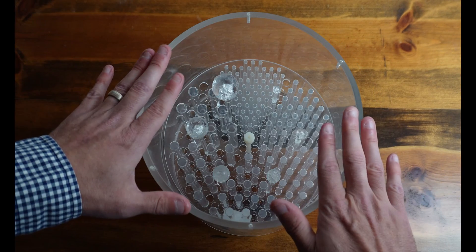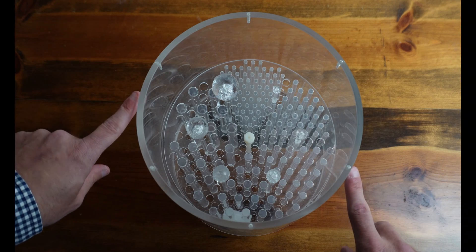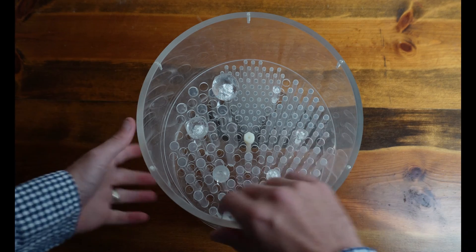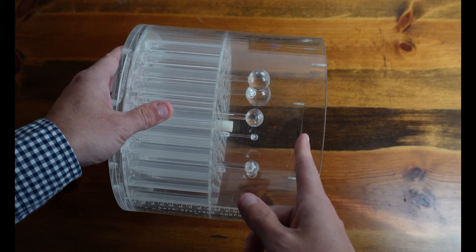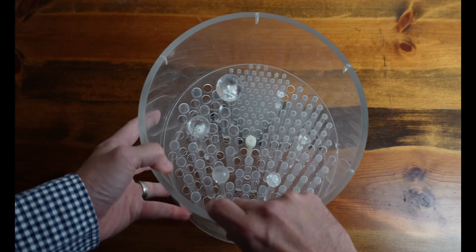So the next thing that we do is we fill the Phantom with water. I usually fill it up pretty close to the top of the Phantom. Fill it all the way up as much as you can. And then we put the lid on it.